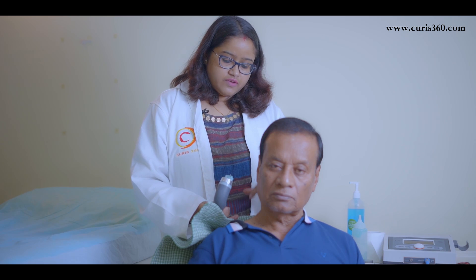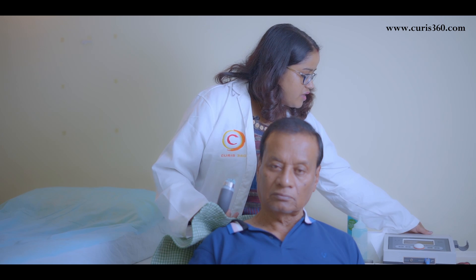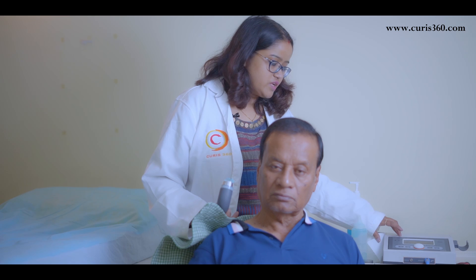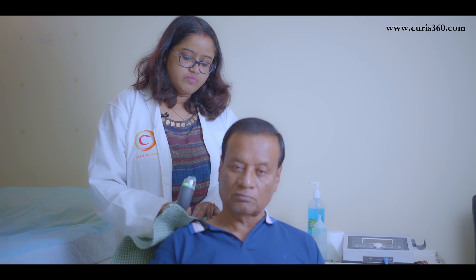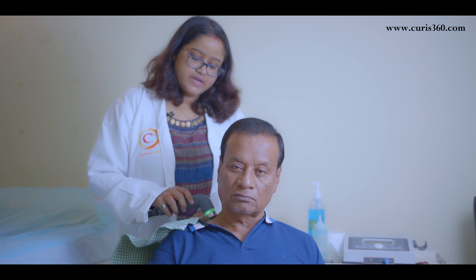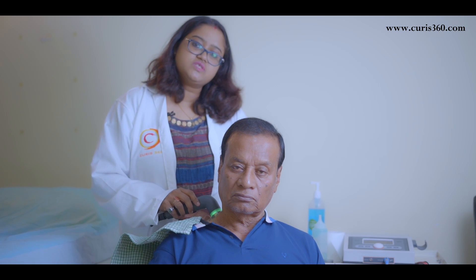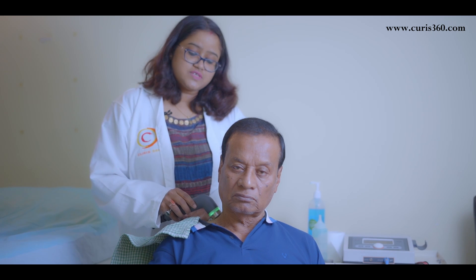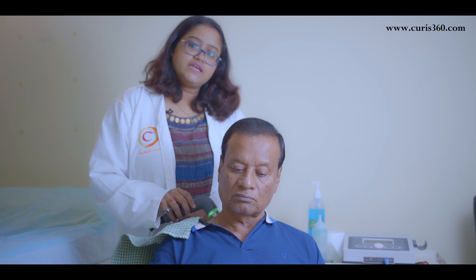I am taking the neck area — if this area is painful, we start the machine and set parameters according to the condition, which will be decided by a physiotherapist. As you can see, it starts showing green because the gel is touching it. If it becomes dry it will show a red indicator, and if the ultrasound head is not touching the patient's body properly, it also indicates. This way we ensure every minute set for the patient's treatment is effectively utilized.